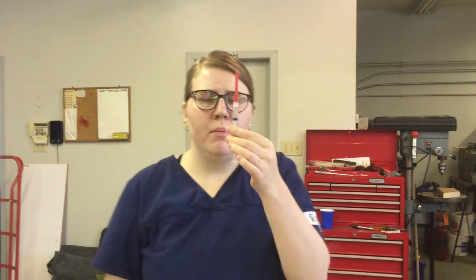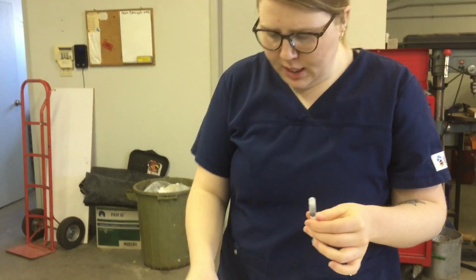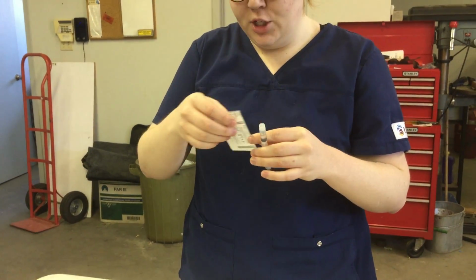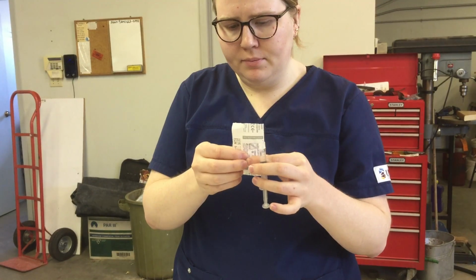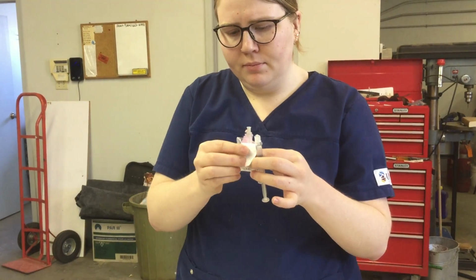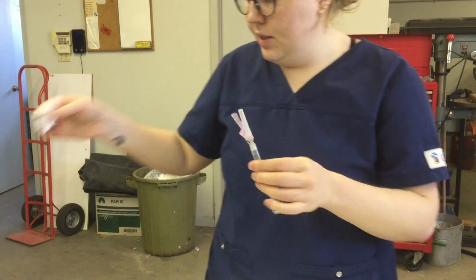So once I've gotten out all my bubbles, I'm just going to pull back to make sure I've got all the medication in the blunt fill needle. At this point, I'm just going to remove my blunt fill needle. I'm going to discard of that in the sharps, and I'm going to open my injection needle here. I'm going to attach this here. Once I've done that, that can go in the garbage.